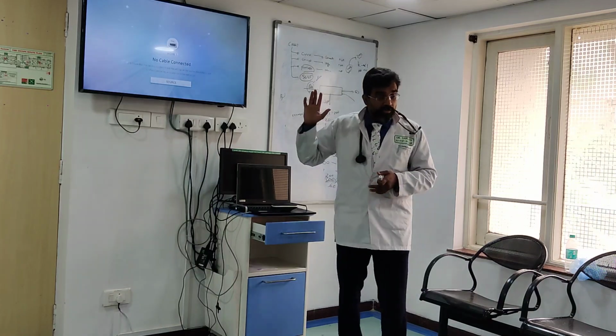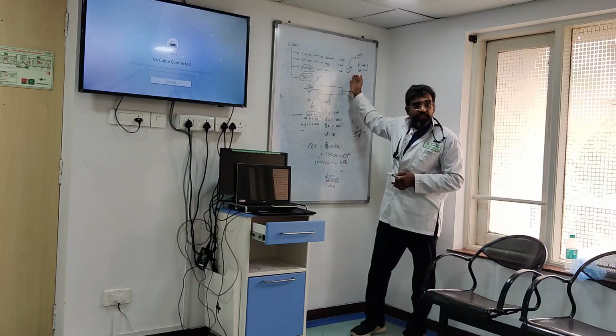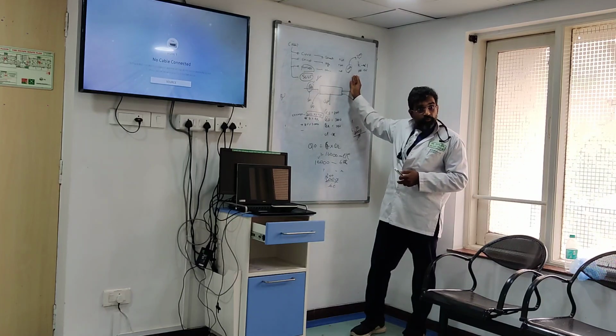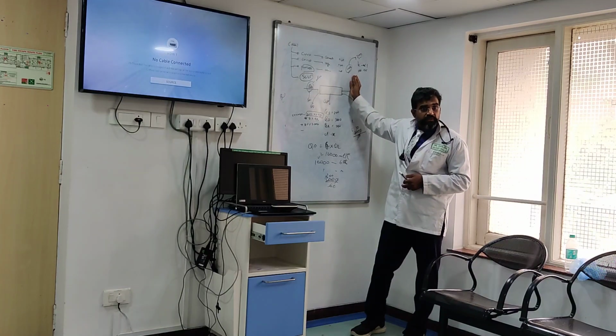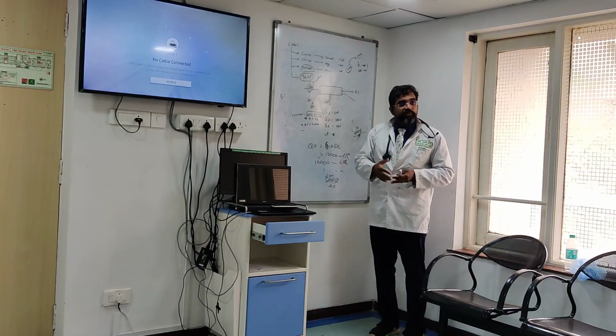Now this is a very difficult scenario because I ideally want to do intermittent hemodialysis. Are you understanding? Because potassium high है उसका, potassium high and bicarbonate is very low. फास्ट निकालना पड़ेगा, लेकिन मेरे को possible ही नहीं है with my CRRT machine. So I want to optimize whatever I can.